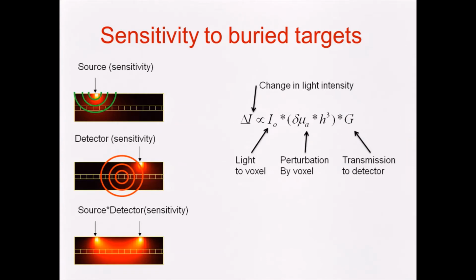So when I want to consider a measurement, any optical measurement always includes both illumination and detection. I just multiply these two functions times each other, and I get this crescent shape. It's a sampling between the source and the detector that is wide and blurry, which is why we can't get crisp images like you can with CT, but we can still model them quite simply, put together mathematical models, and understand how all this works if you want to design an instrument.